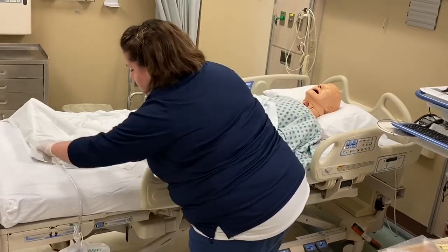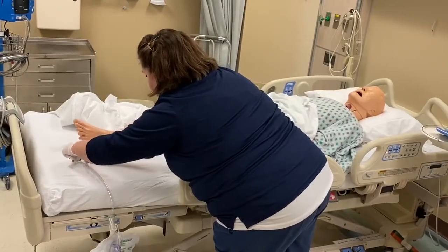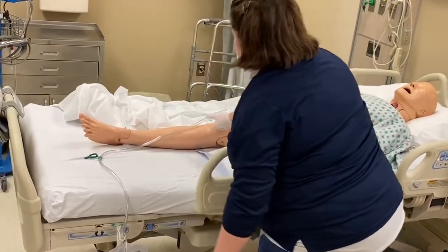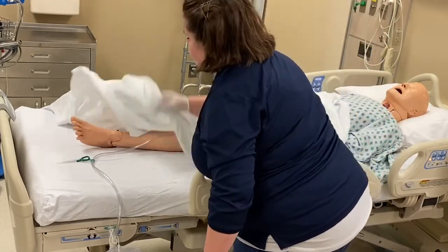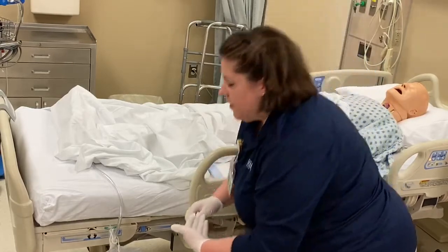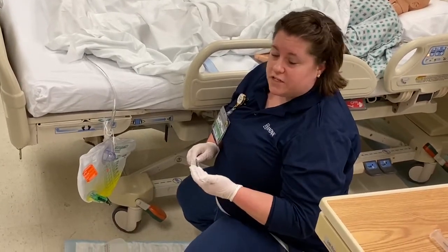And if I put the clip closer to the end of the bed, I'll figure out how it works best with my patient's position. If I clip it onto the sheet right here, I'll have a nice straight line into my catheter, no dependent loops, no urine buildup. All right, so I'm gonna get down on the floor to the level of my bag, because I never raise the level of the bag up. It always needs to stay below the patient's bladder.